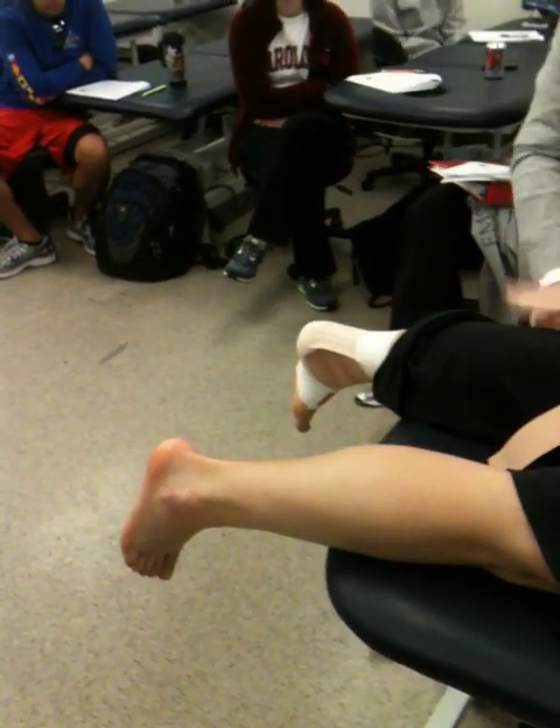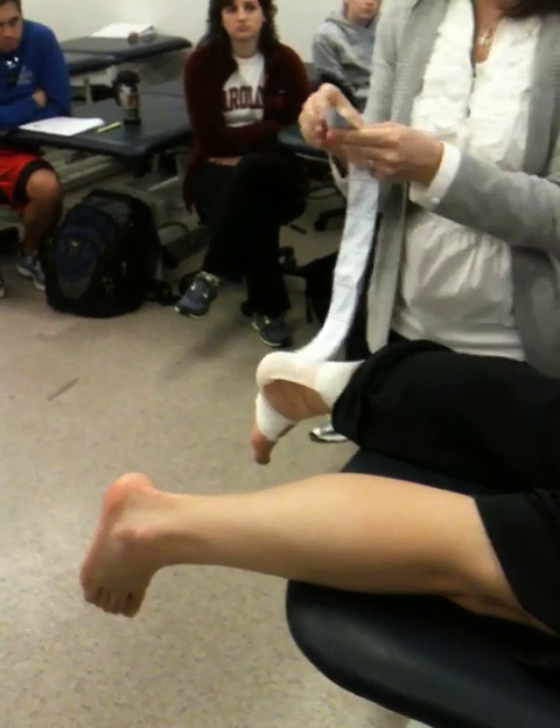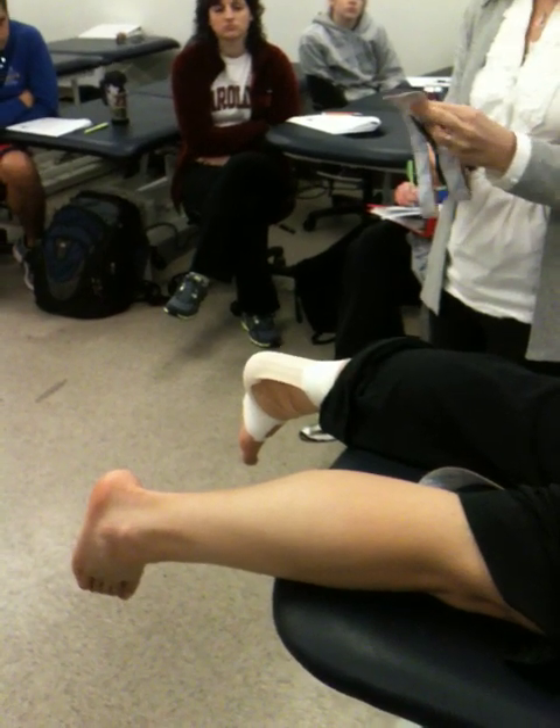I'm going to come around that gastroc head. In the kinesio world they say the tape gets caught on clothing and socks, so round out your edges. One of them I'm going to split in half for the gastroc, and you'll leave a base of about two inches or so.